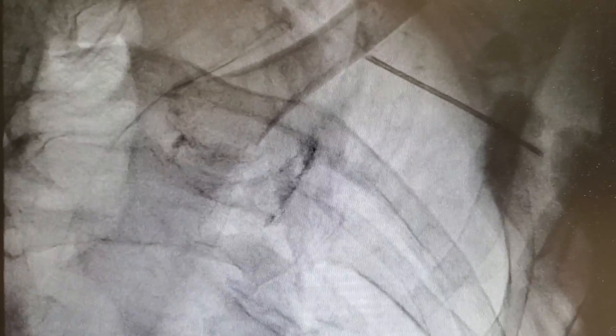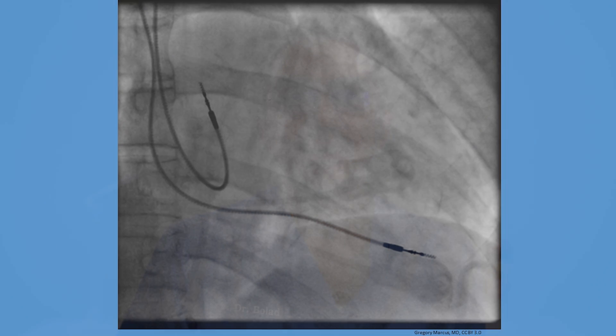This is how it looks on the x-ray. Through that needle a wire is passed, and on top of that wire a sheath is passed. Through the sheath, the pacemaker wires are passed and attached to the heart as shown in these images.